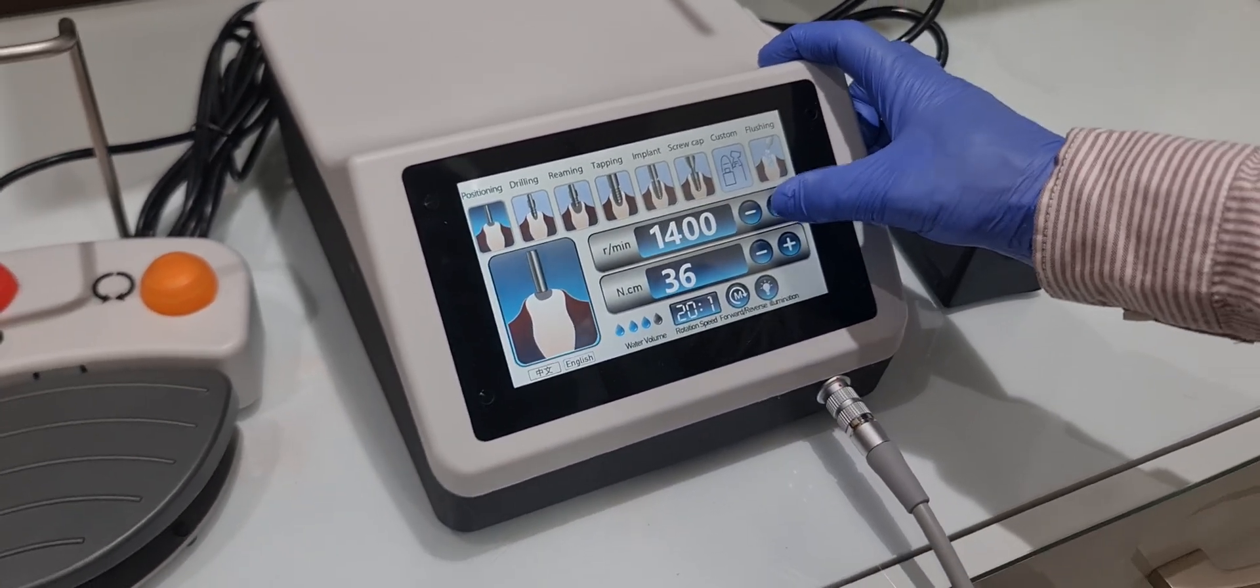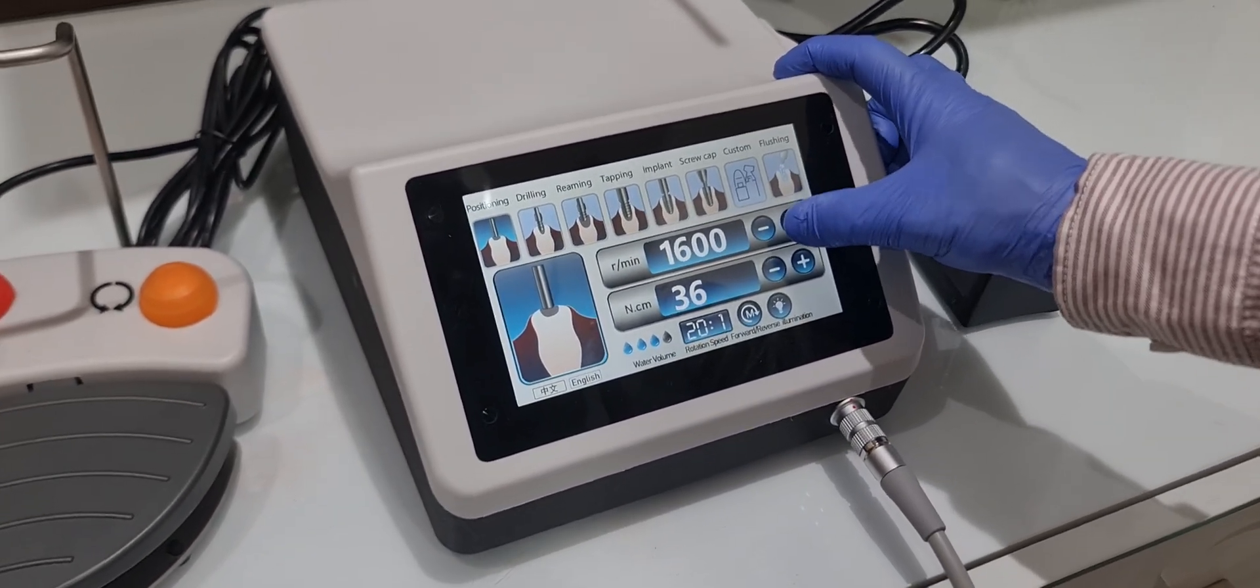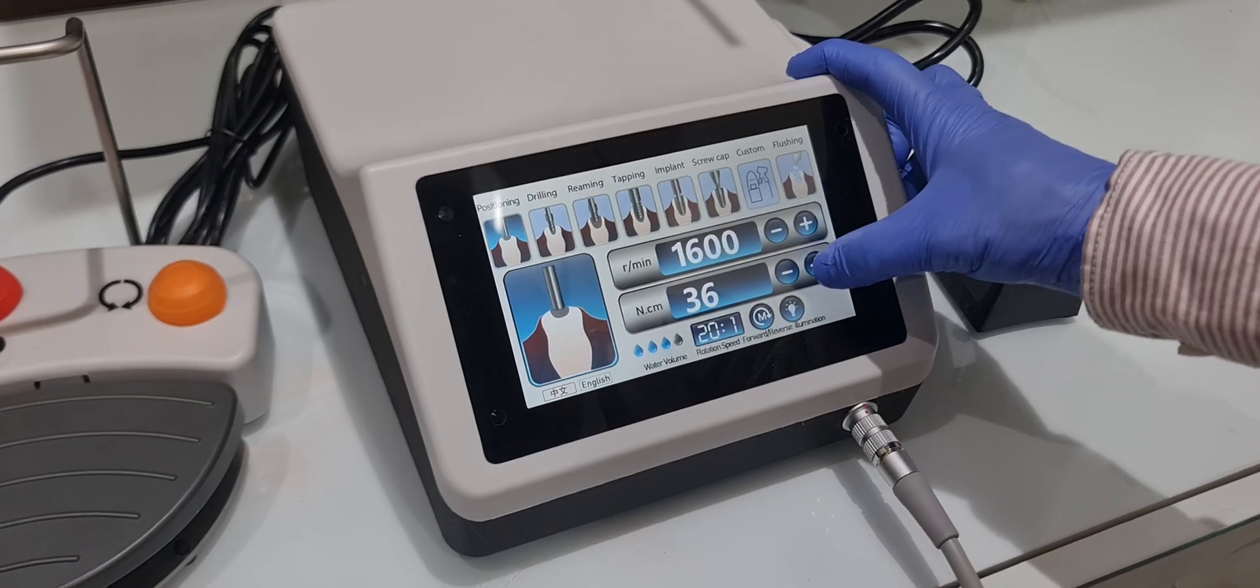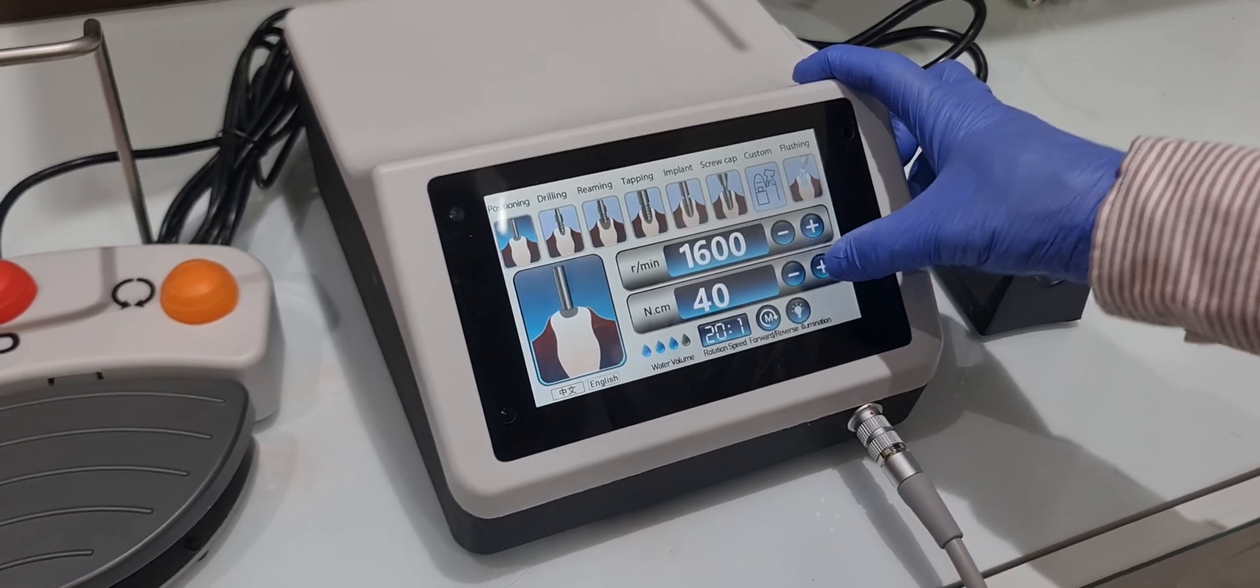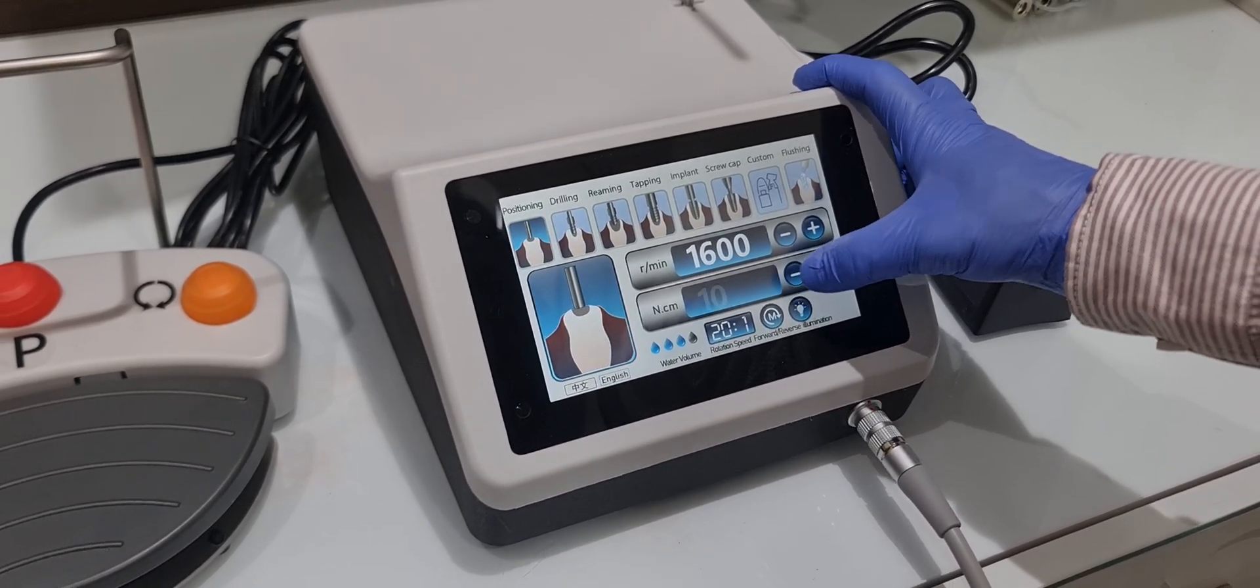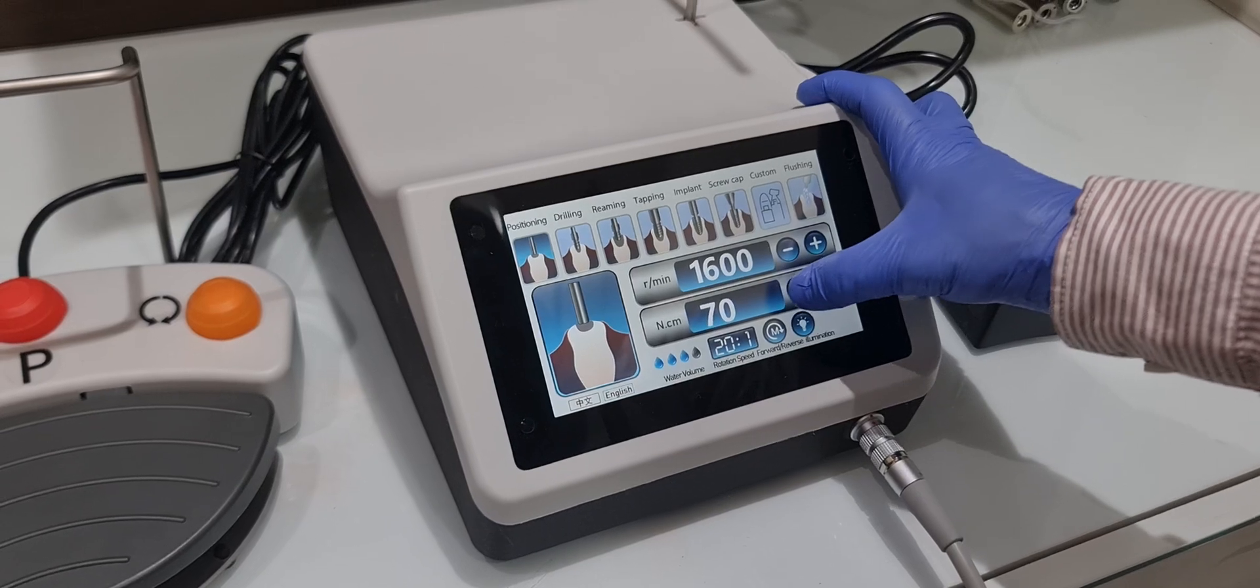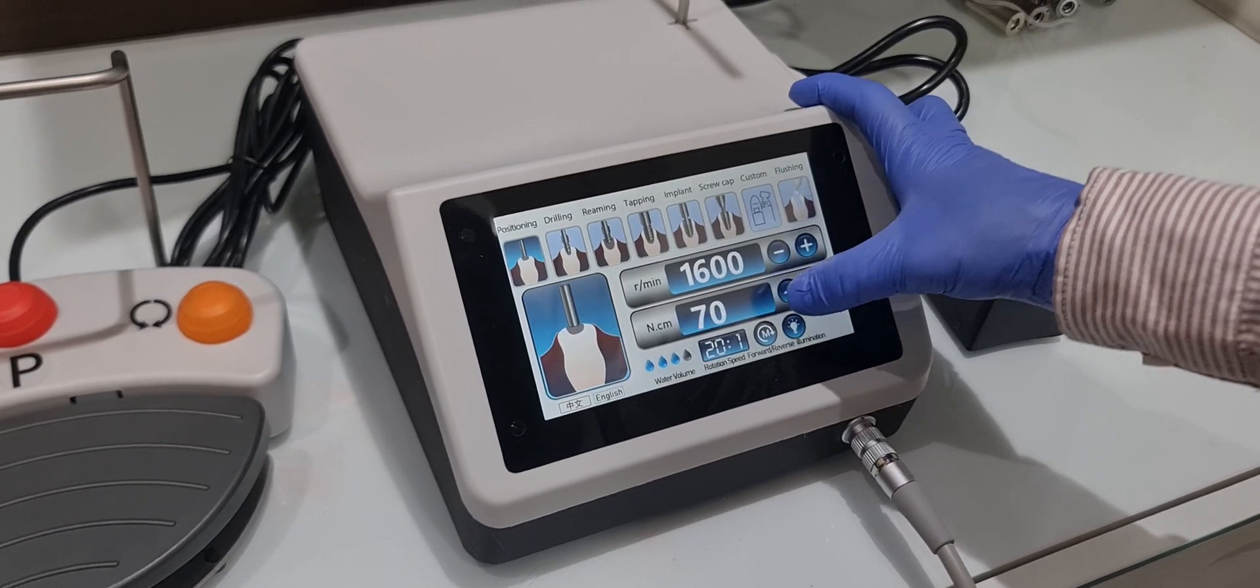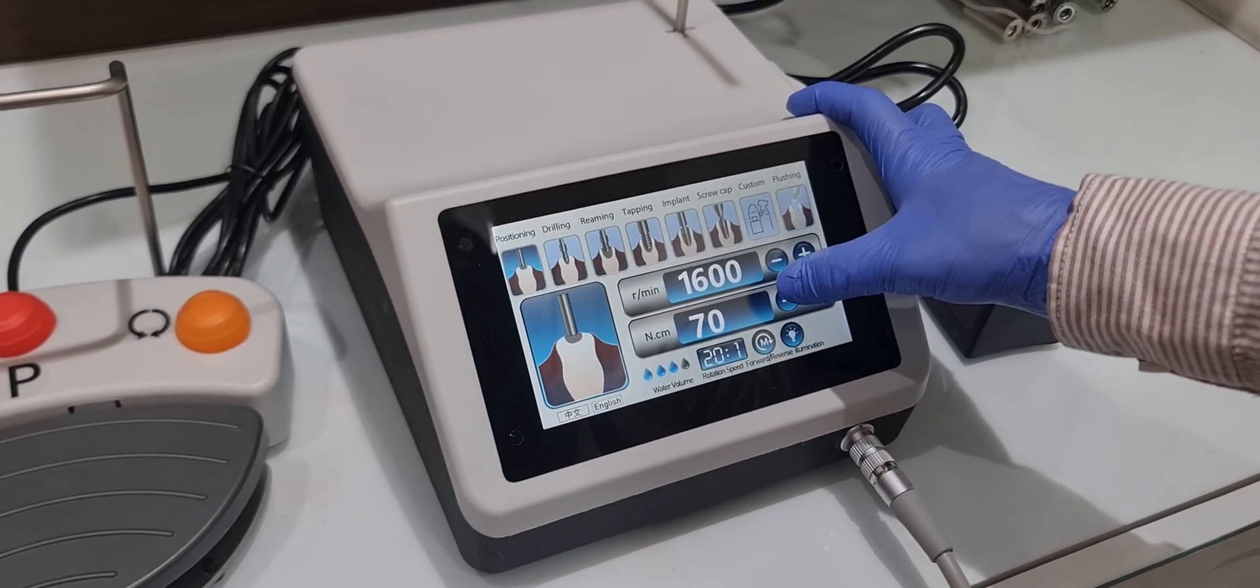RPM you can set. Here is the torque, torque up to 70.